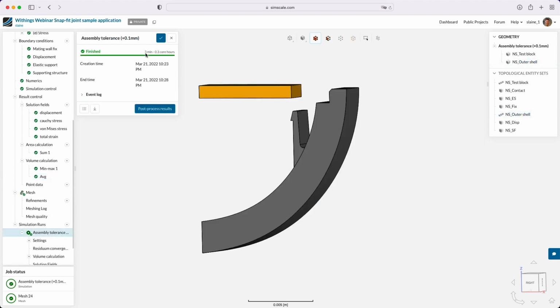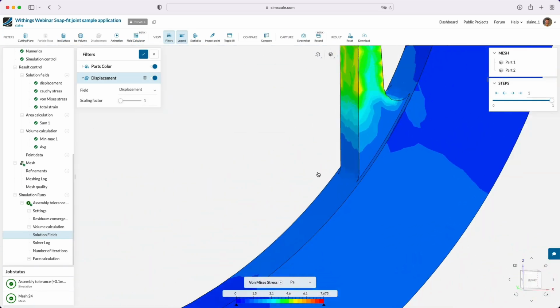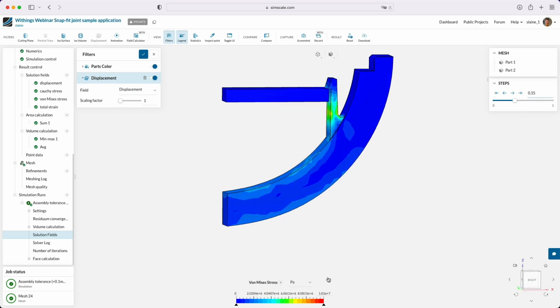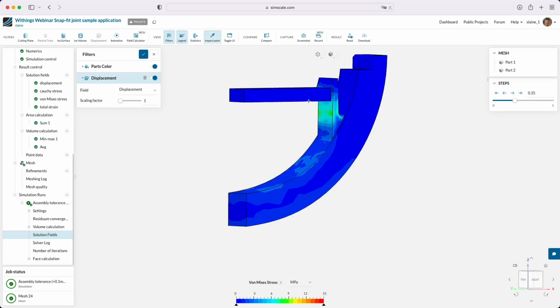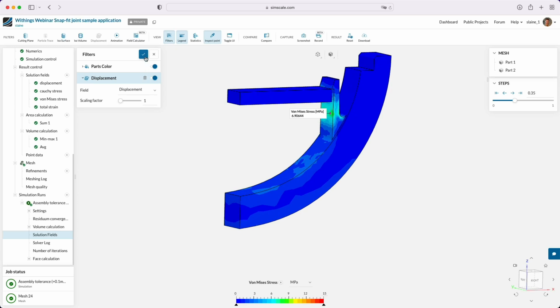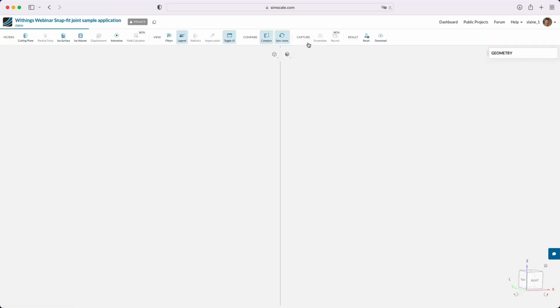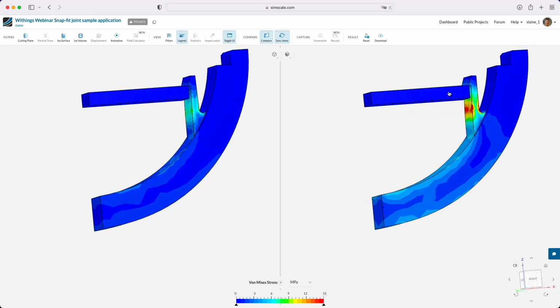So our simulation is completed. It's completed there in 3 minutes and 0.3 core hours. So now we could obviously post-process this just like we did with the other ones. So we can have a look at our simulation, go to the 0.35 time step to see the stress that we've got, and just format this so it's equivalent to the others that we were looking at, and we can see that the stress there is much lower in the part, to be expected because we've got a larger gap between these two components. And of course we could directly compare that with the nominal or the lowest assembly tolerance. So it is in fact much lower stress than the nominal assembly tolerance.